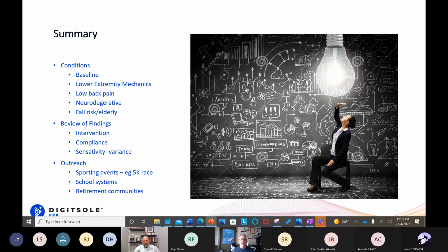The other thing I like to do is relate it to some of these changes that are associated and say, okay, look, you've got a really bad distribution of your weight pattern. We need to do something about that knee before it gets to a point where you might have too much degeneration that results in a joint replacement, for example.